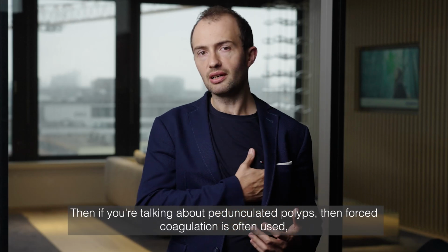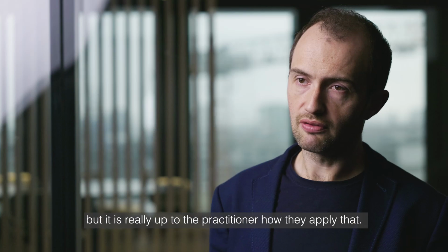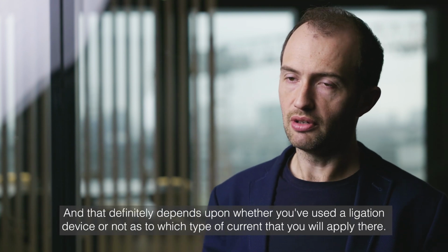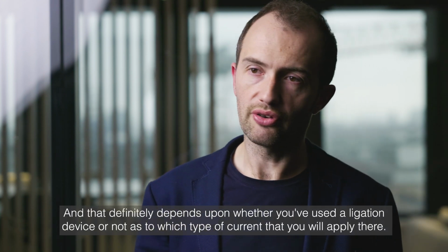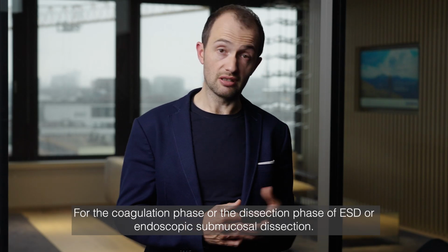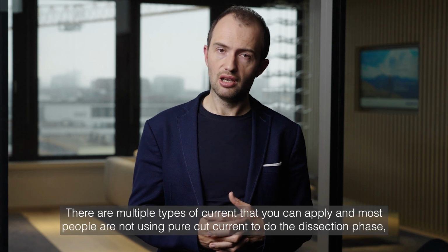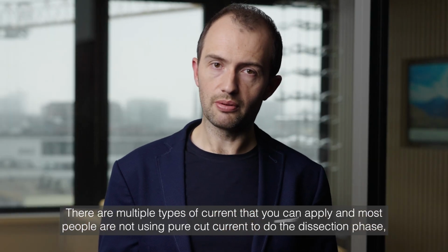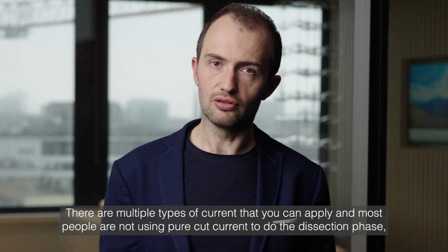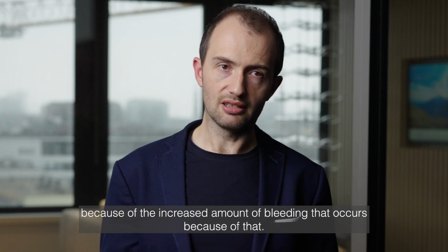Then if you're talking about pedunculated polyps, then forced coagulation is often used, but it is really up to the practitioner how they apply that. And that definitely depends upon whether you've used a ligation device or not as to which type of current you will apply there. For the dissection phase of ESD, or endoscopic submucosal dissection, there are multiple types of current that you can apply, and most people are not using pure cut current to do the dissection phase because of the increased amount of bleeding that occurs because of that.